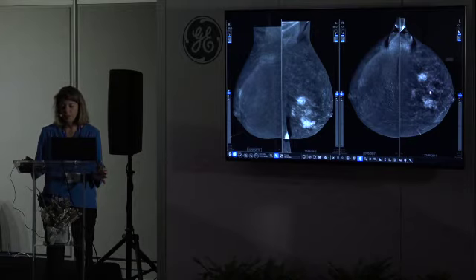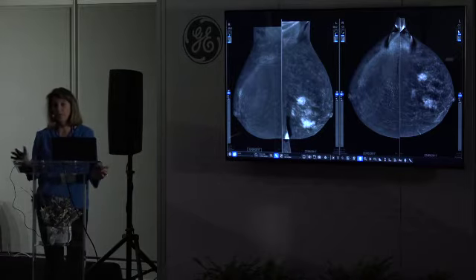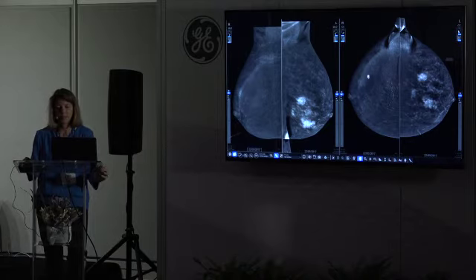And also we have contrast uptake between these three more obvious masses, which are not really a mass, so what we also call in CEM a non-mass enhancement. It was also DCIS linked to this case. In this case, she also has dense breast, and we have a slight background enhancement. We can have this also with CEM, usually less important than we could have on MRI, but it's still possible to have background enhancement. In this case, a little bit of breast-in-breast artifact. It was only background enhancement here.